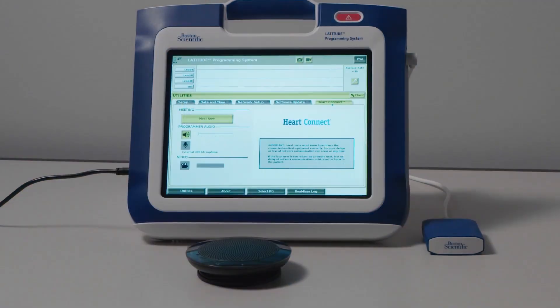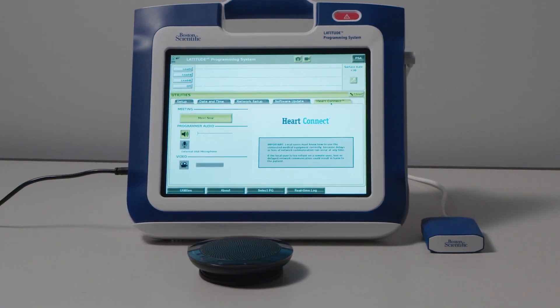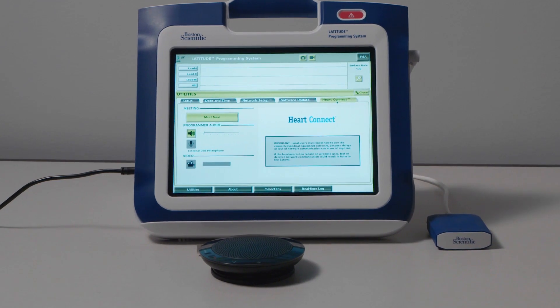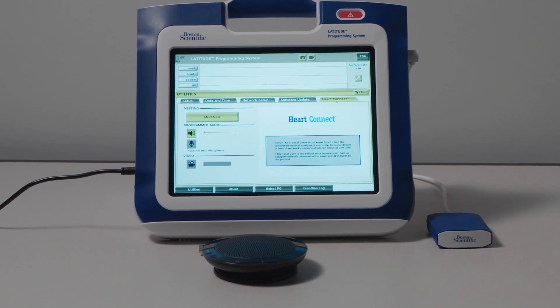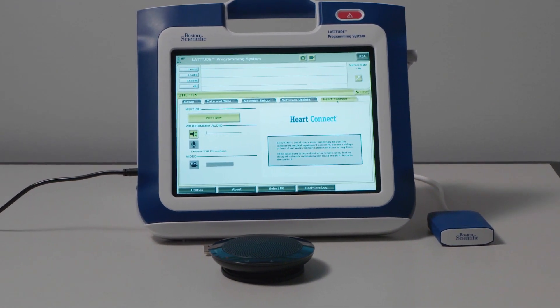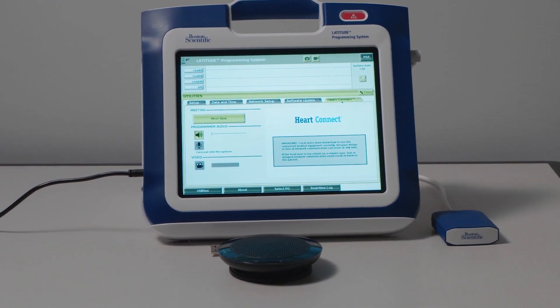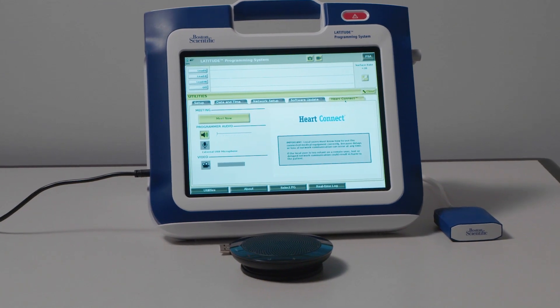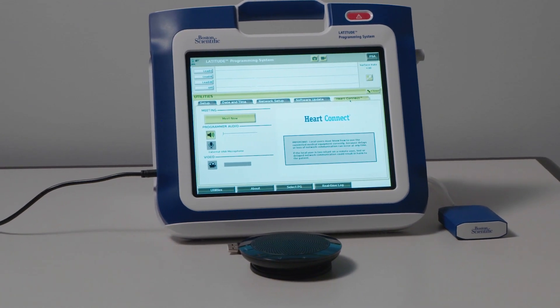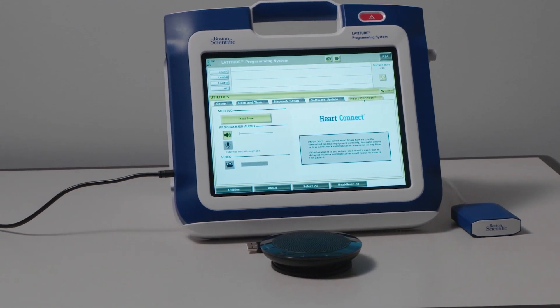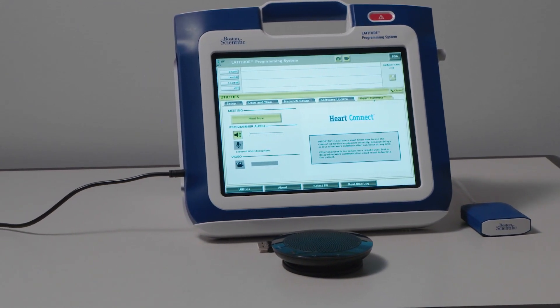The main components of the HeartConnect system are the Model 3300 Latitude Programming System, an internet connection, the HeartConnect app set up via a BSC representative, and a supported microphone and speaker.